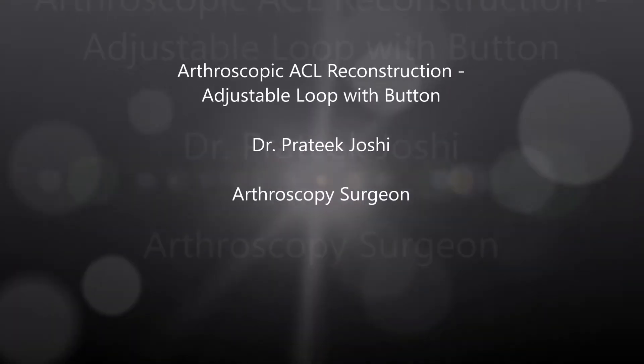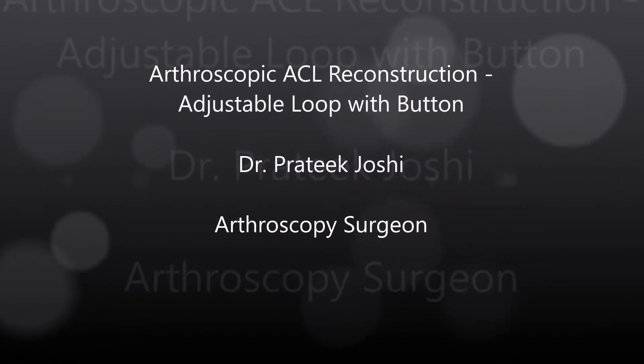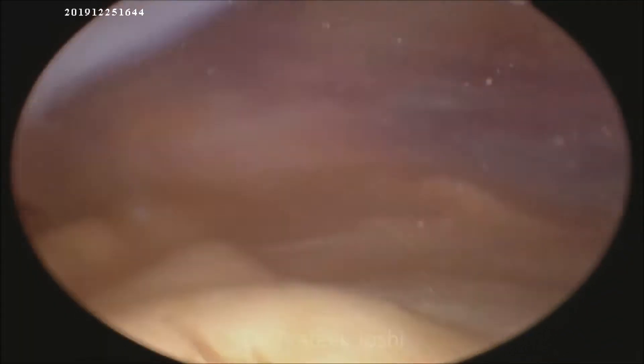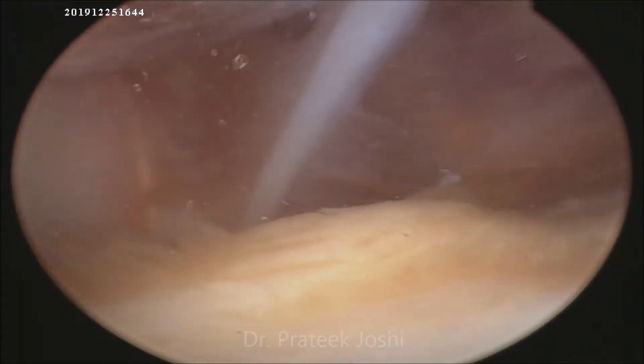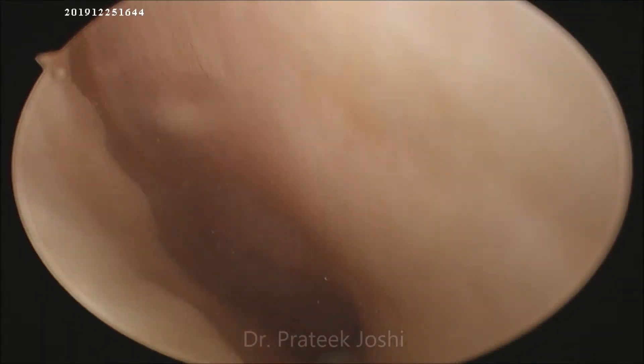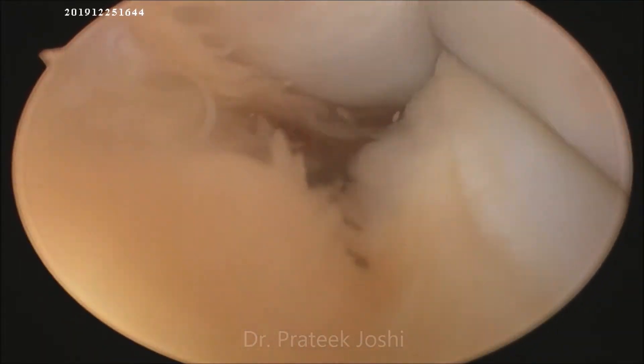Hello everyone, I am Dr. Pratik. I am going to demonstrate arthroscopic ACL reconstruction using an adjustable loop with button. We will begin with diagnostic arthroscopy.